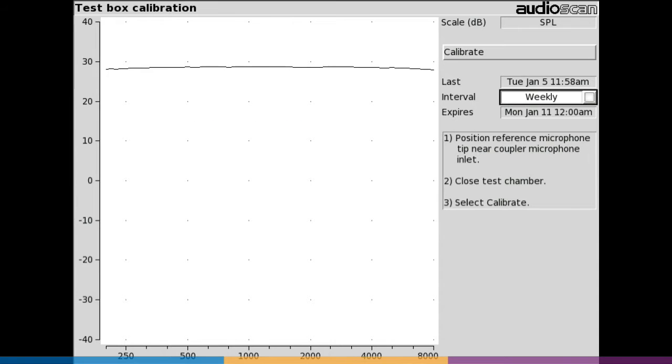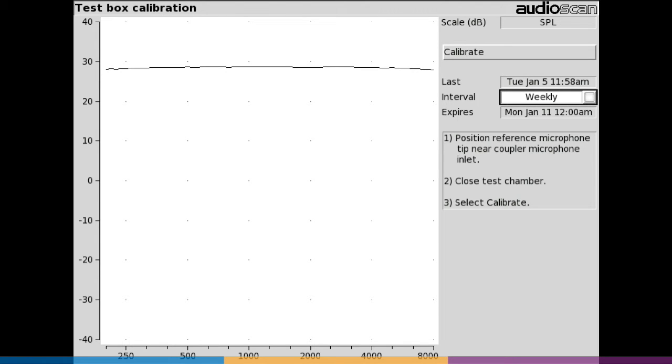On AudioScan equipment, the coupler microphone is factory calibrated to have a flat frequency response and a specific reference level. The user calibration process compares the reference microphone to the coupler microphone response and stores a curve which is used to compensate the reference microphones in all TestBox measurements.